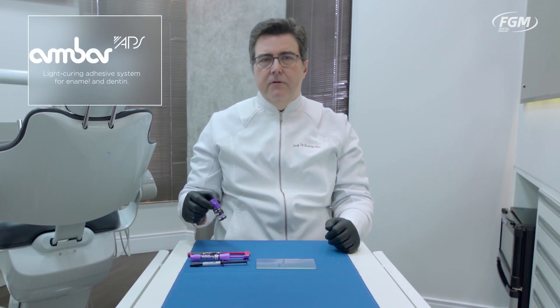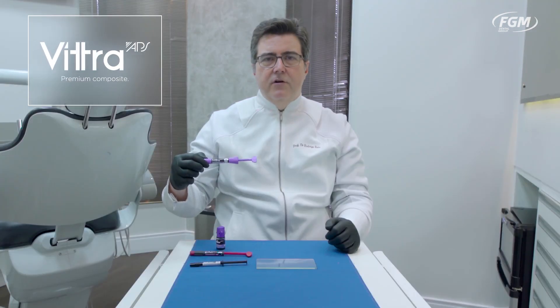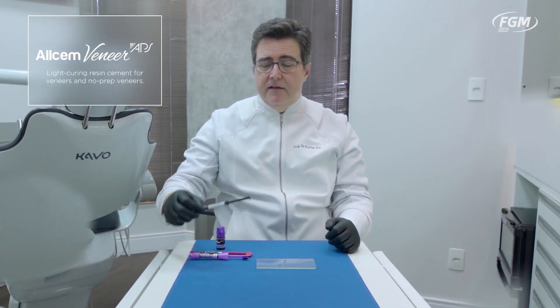APS is available by FGM on dentin adhesives, universal adhesives as well, bulk fill composites, high aesthetic restorative composites, and visible light cured cements for laminate veneers.